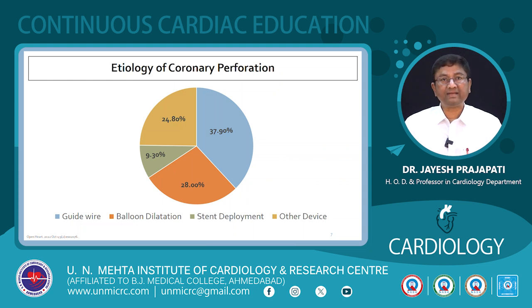And while post dilating, we have to be very careful to avoid the perforation. Another, because of other devices like rotablation. So rotablation also in a very tortuous lesion, we have to be careful, and while doing the rotablation, the guiding catheter should be hooked properly, should be aligned to avoid the perforation. Sometimes a burr can jump and can perforate. Atherectomy devices can also lead, very rarely IVL also, but laser also can lead to perforation.